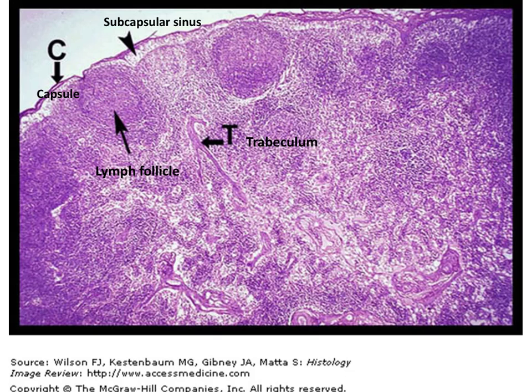Here are the lymphatic nodules, and we have here the medullary cords, the dark blue, and we have here the medullary trabeculum or septa, which is red, and the area in between the cord and the trabeculum is the medullary sinus. So this is another picture for the lymph node.